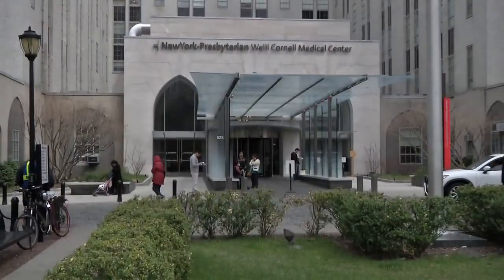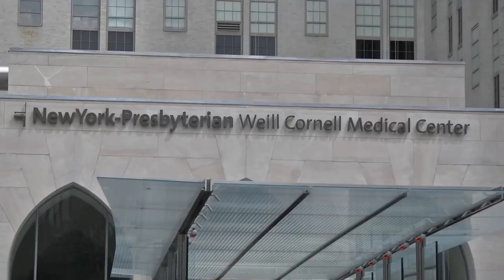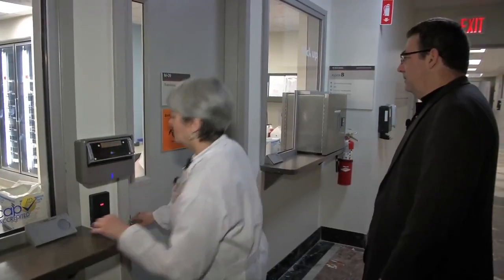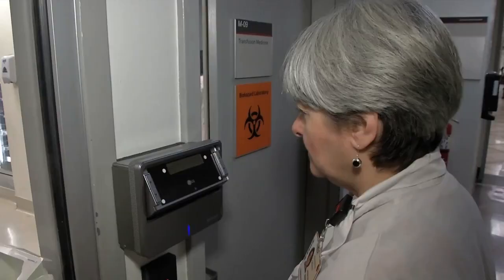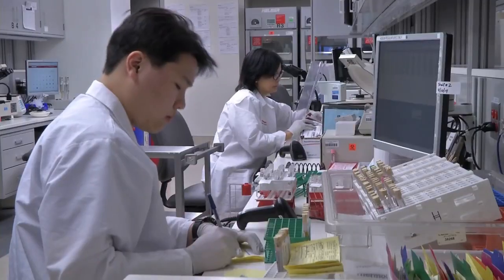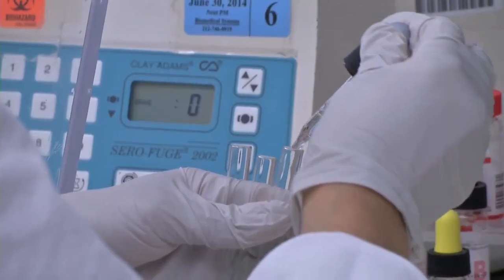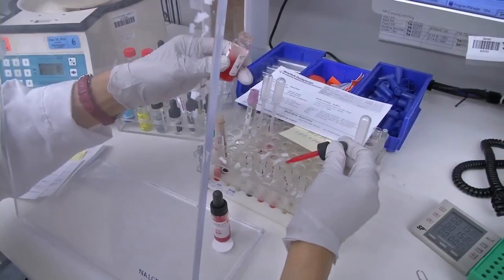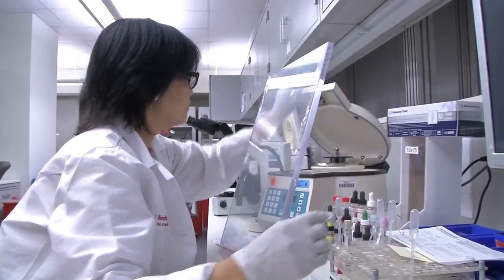Central Dispatch sends the blood products to hospitals like New York Presbyterian, Weill Cornell on the east side. There it's kept in a highly secured blood bank. Transfusion medicine and cellular therapy manager Kathleen Crowley undergoes an eye scan to enter. Inside, technicians test their patient's blood type, ID a potential donor match, and mix a sample of both to ensure compatibility. One of at least 20 checks to ensure the right blood is going to the right patient.